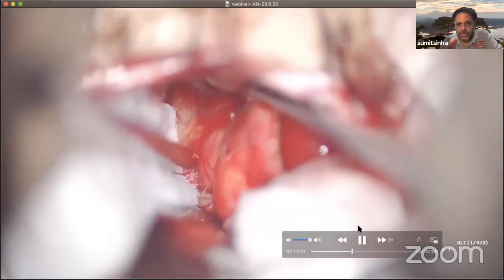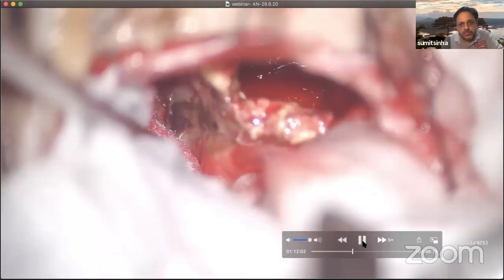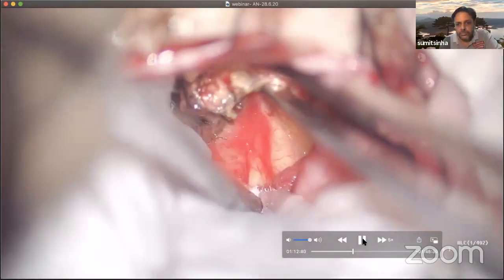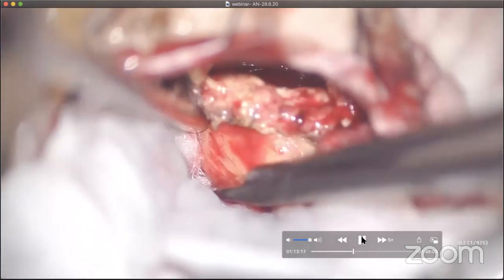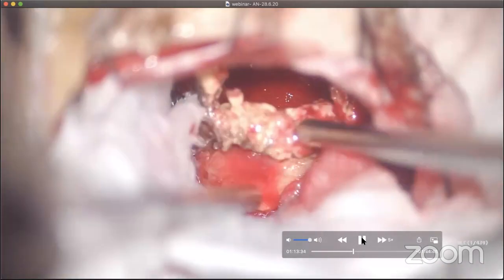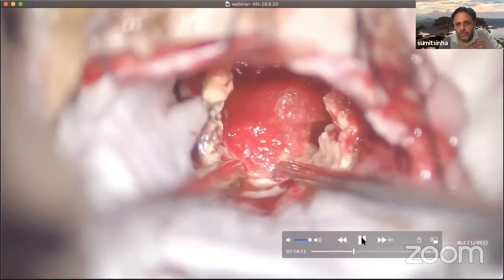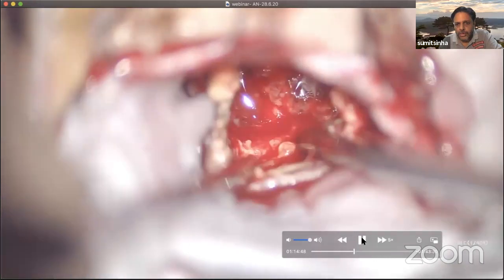Sliding the cotton patty between the arachnoid membrane and the tumor capsule so that the plane is maintained. More debulking from the medial side. More debulking from the depth from the medial side.